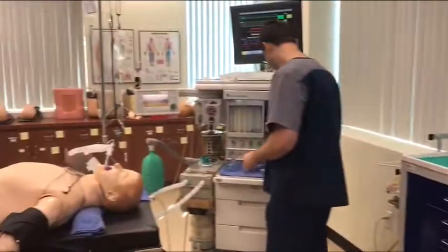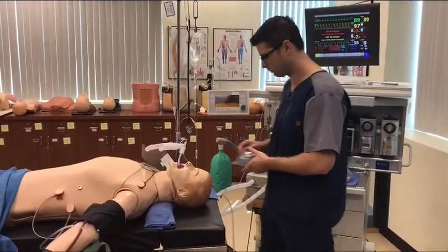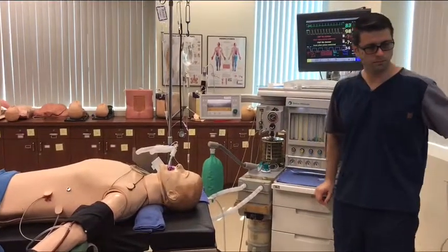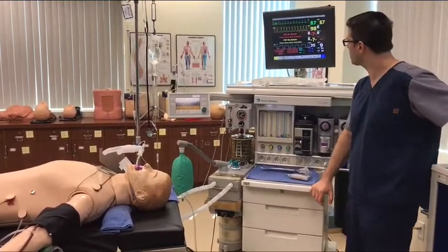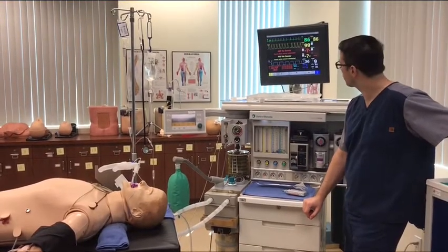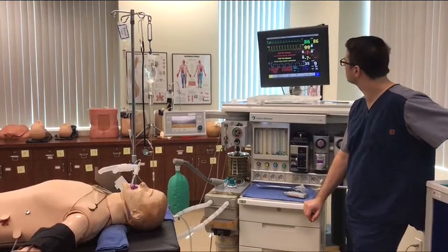Get your mask up there. So talk to me about some of those things we just talked about, Liviu. You're doing great. Talk to me about some of those things. I want to make sure that my patient's vitals are fine. Are they fine?